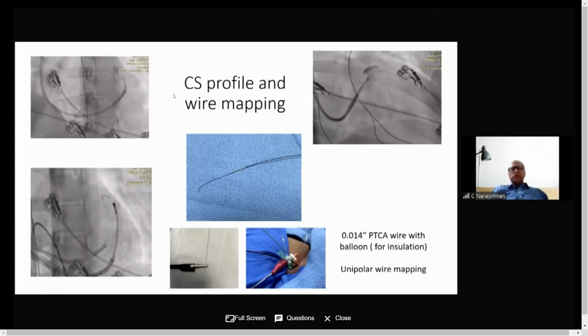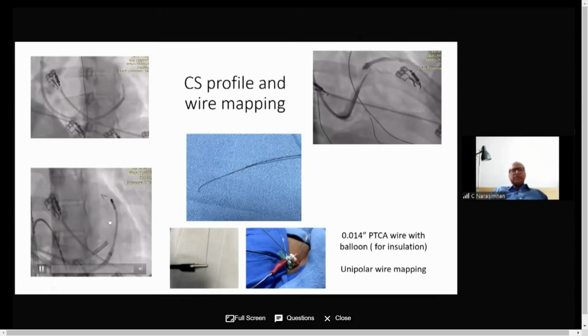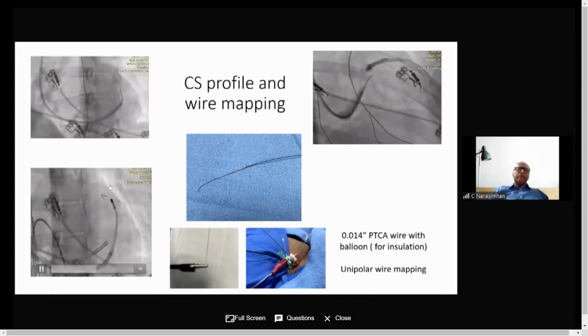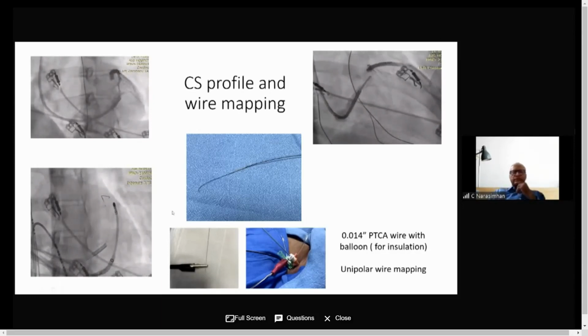One of the useful things is what we do before you consider epicardial, are you able to see my screen? Yeah, can see. Okay. So we introduce a guide wire into the venous branches of interest. For example, in this patient, distal coronary sinus was early. So we put an endocardial catheter here and then before getting an epicardial access, we map from the vein using a guide wire. If this area is not early, but endocardium is early, you go to the endocardium transeptal. Whereas this gives a rough idea even before you make a puncture. These are some useful tips that you can take up.